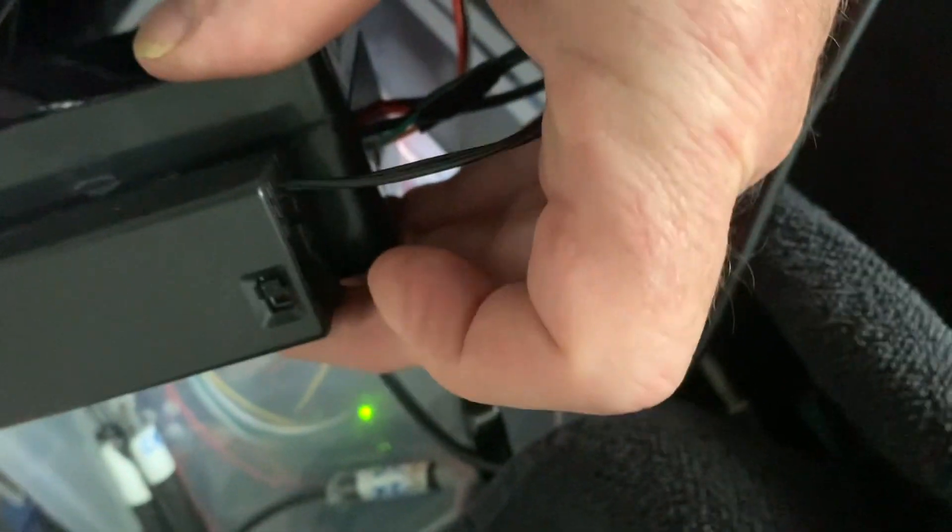Turn on the unit and it should be ready to go. I'll grab the laser and turn it on. You hit the switch and the laser comes on. Then you can try to find a place to put it so she can turn it on and off with the foot switch.